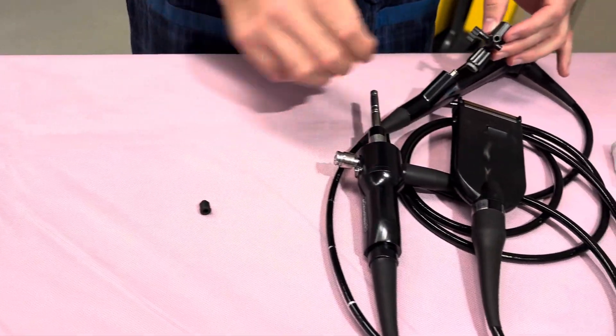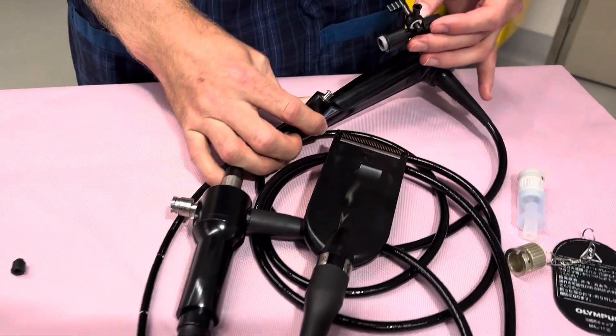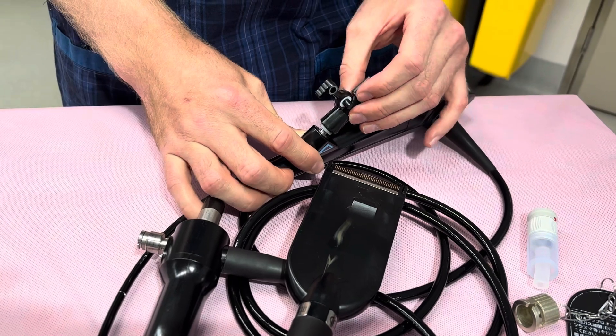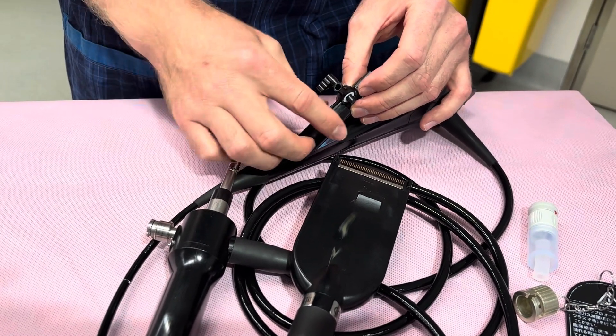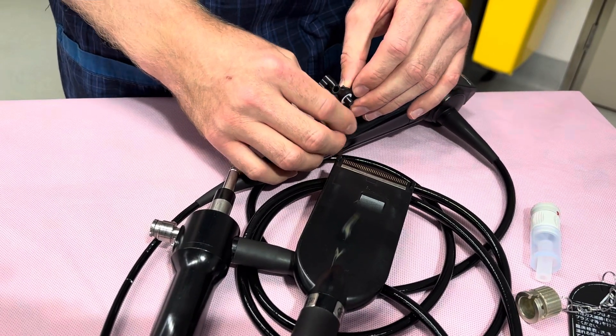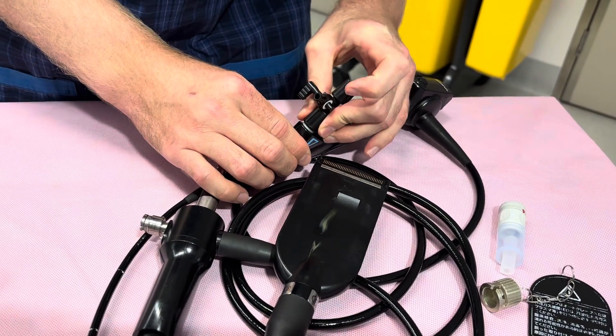Once you've done that, it sits over where you took the booster off, onto the silver, and just screws down. Make sure that is facing up because that's where your giving set will attach for the fluid. Screw it on like so.